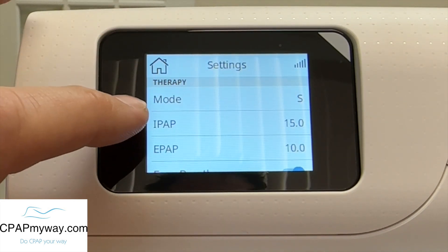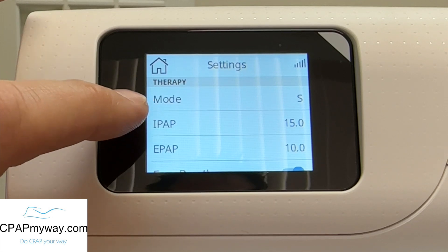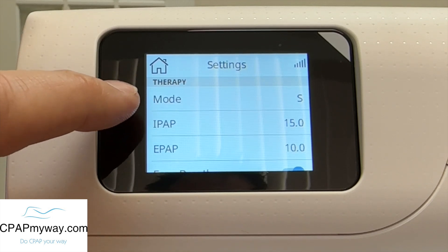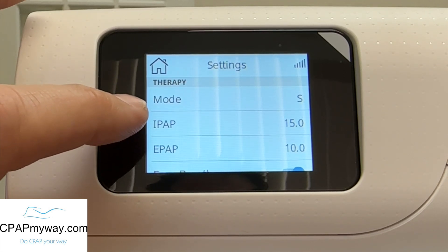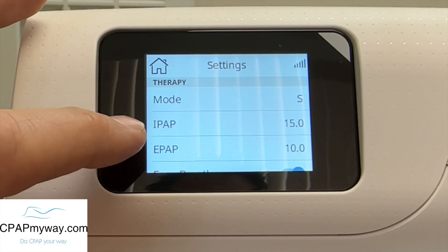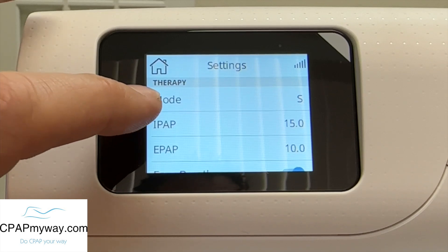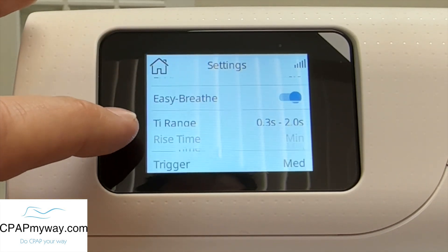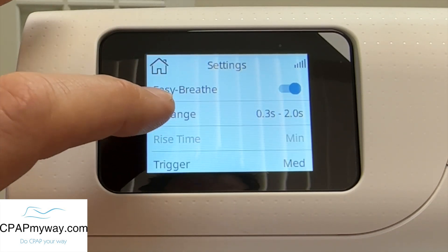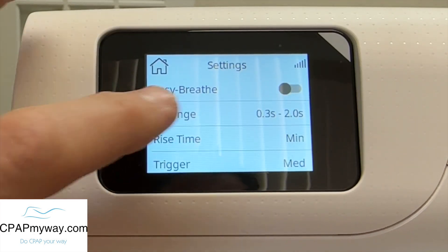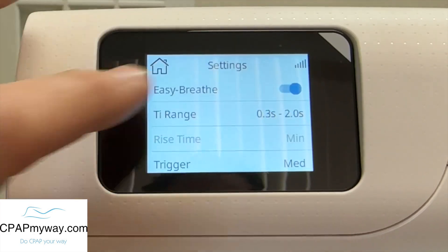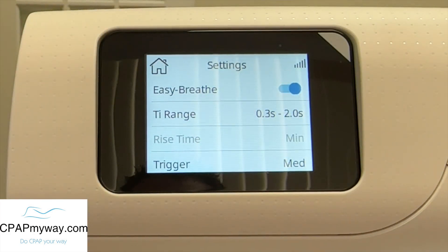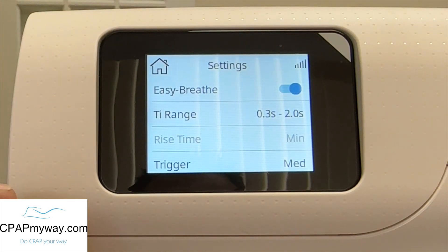You've got it in S mode. As far as the therapy settings go, in the pressure settings, you've got IPAP and EPAP — that is your inhalation pressure and your exhalation pressure. It also gives you the option of turning EasyBreathe on or off. That's a comfort feature to help somebody, especially a new user. It's nice to have EasyBreathe on.